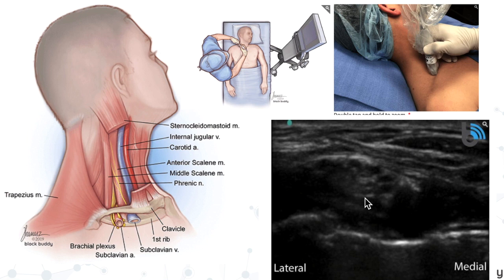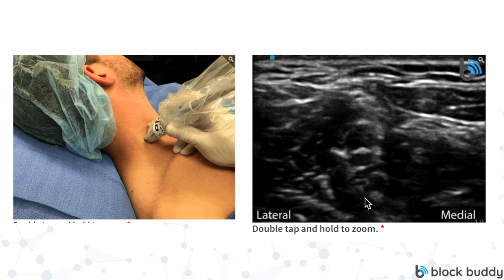Here is an overlay of the brachial plexus and the subclavian artery with the hyperechoic first rib. This will be our landmark when starting to do an interscalene nerve block. Once we see the subclavian artery and brachial plexus, we're going to gently slide the probe up the patient's neck and flatten it against the neck looking straight down. While sliding up the neck, you'll watch that little bundle of grapes turn into a snowman or stoplight — three anechoic black circles: C5, C6, and C7, stacked on top of each other.